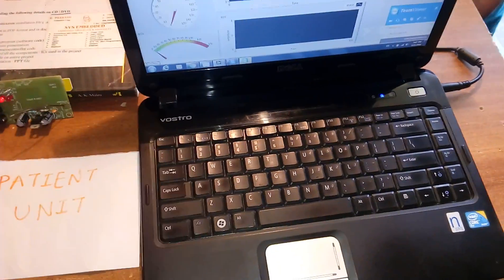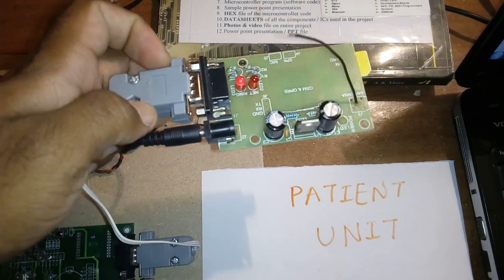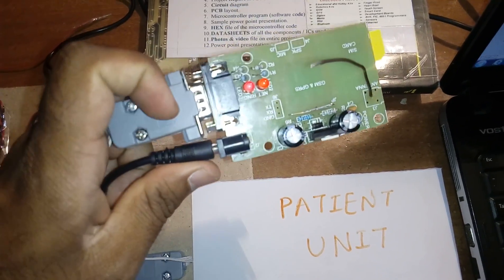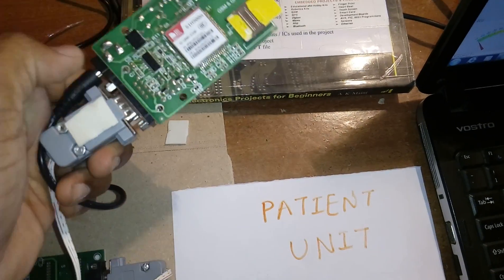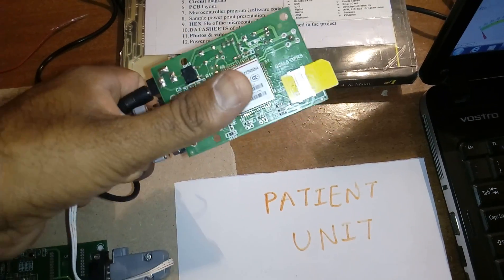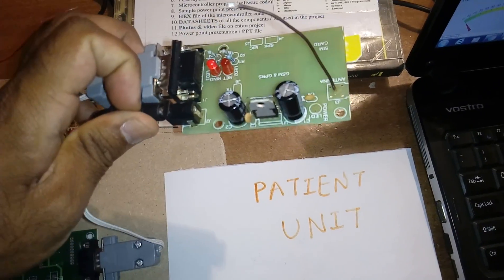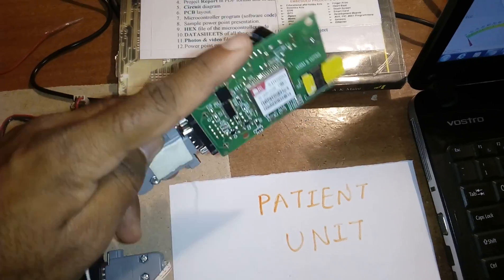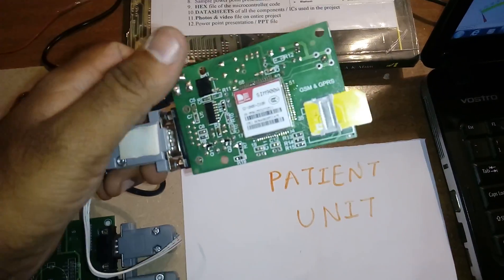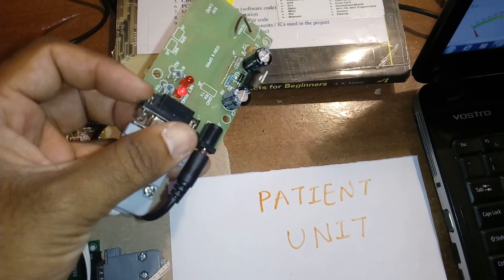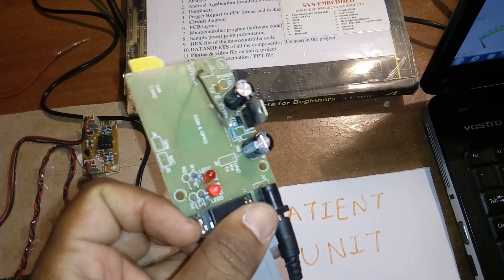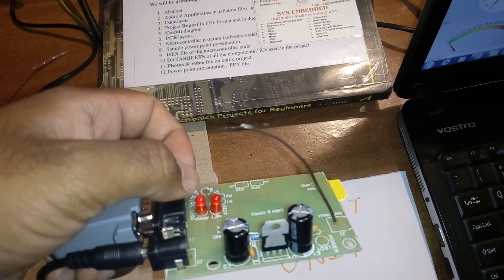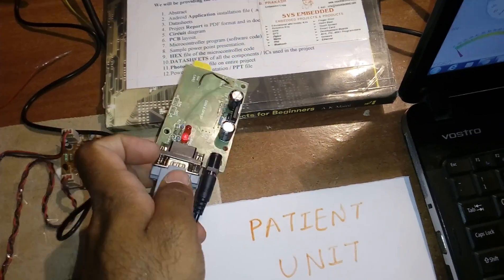We are using one GSM SIM900 GPRS module. You can connect micro SIM card and big SIM card. It has bridge rectifier, filter capacitors, and one LM317. This GSM module requires 4.75 volts, so that's why we have LM317 regulator. Here is the network LED and one ring LED. This is the entire GSM module.